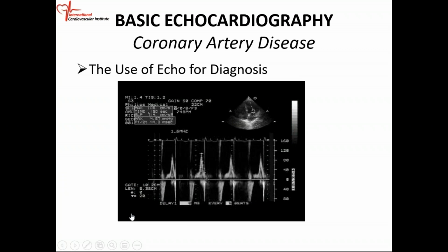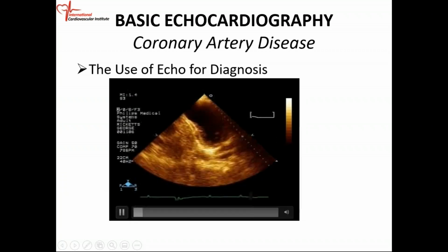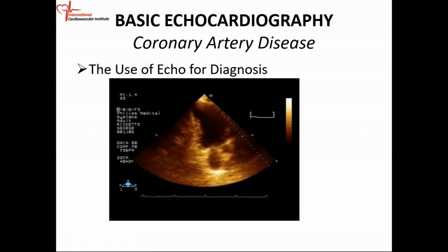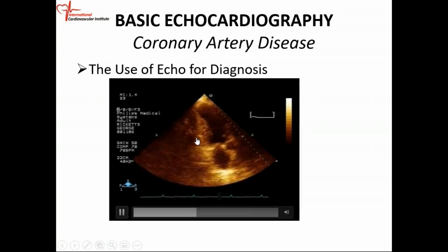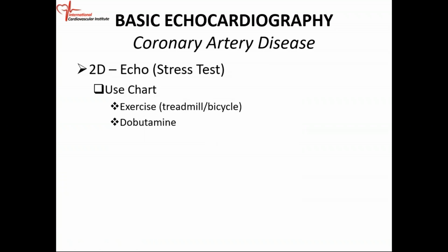And then you can do your Doppler studies to look at diastolic function and dysfunction. You need to do all your views. So remember your apical two-chamber views, because you want to look at all the segments. Okay, and I think we have a little revision of going over the segments, so you have to be familiar with the segments.